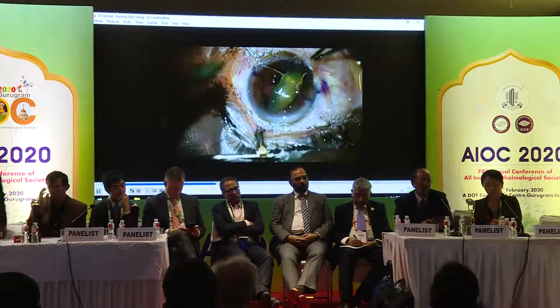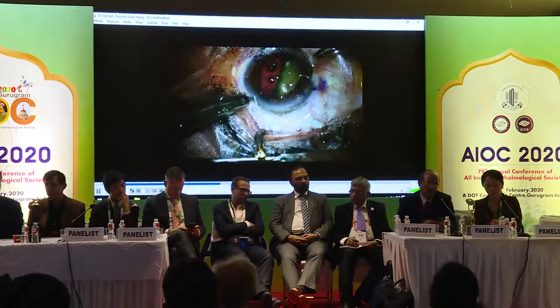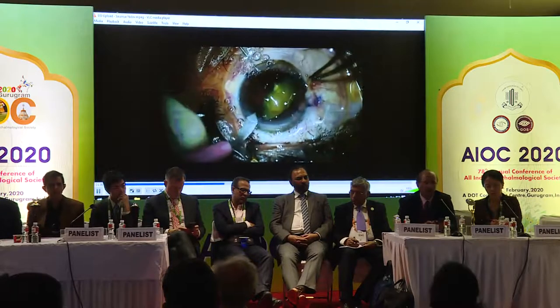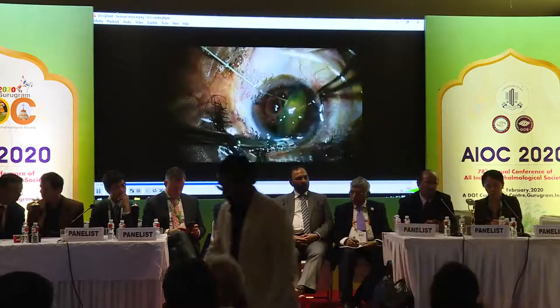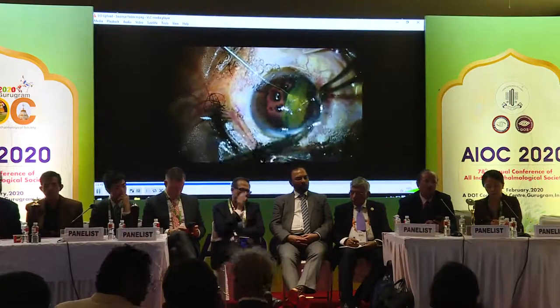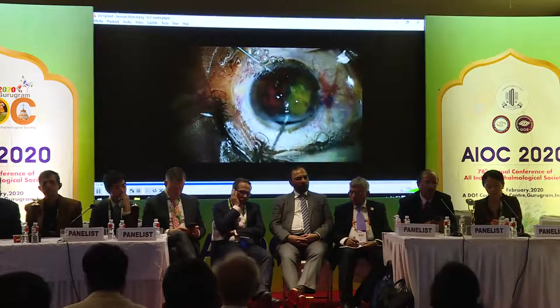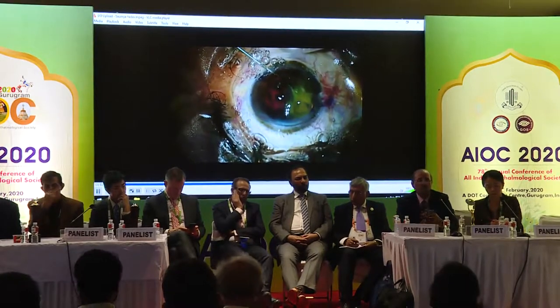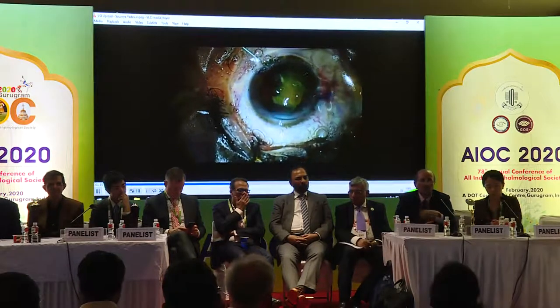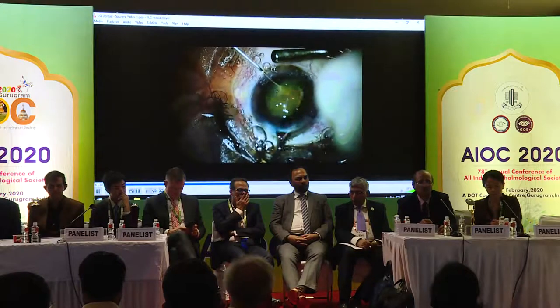Without causing any further manipulation of the cannula, we converted the phacoemulsification into an intracapsular cataract surgery via a superior approach. Till the time we delivered the lens, the viscoelastic cannula was held in place by the assistant and was used as an anchor at the time of delivery.